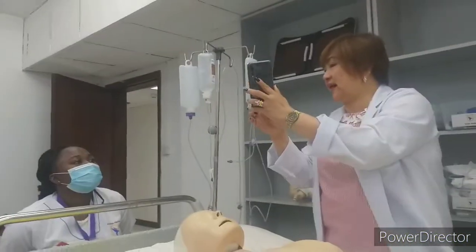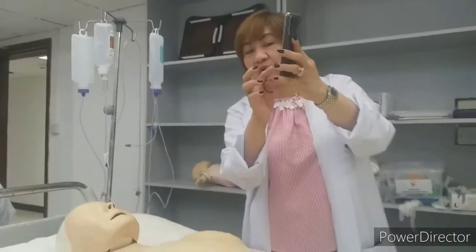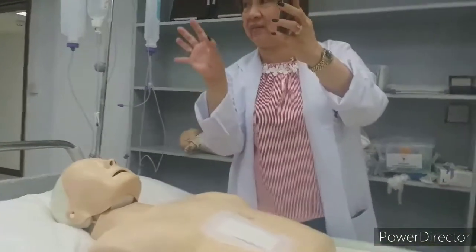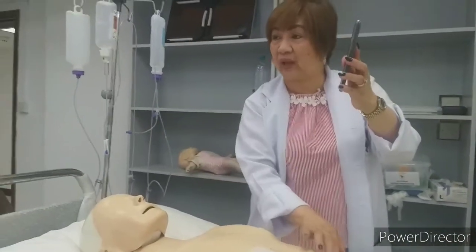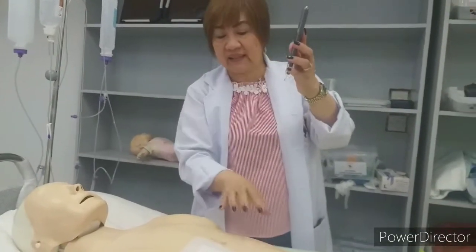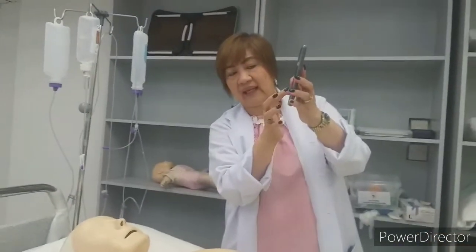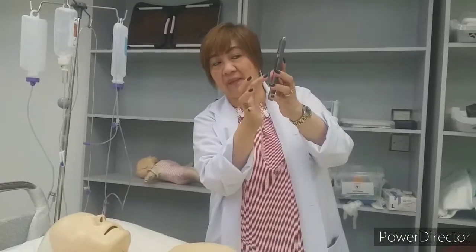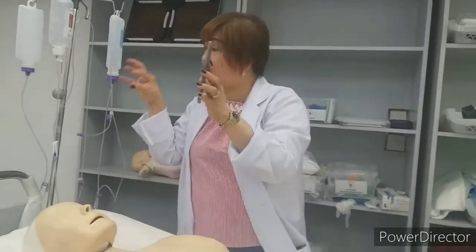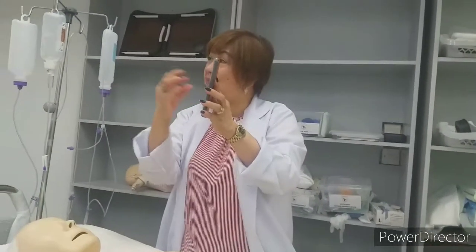There is a pad that you lay out under, just outside of the stomach. This is what I'm talking about, like a zip bag. Over here, you attach the colostomy bag.